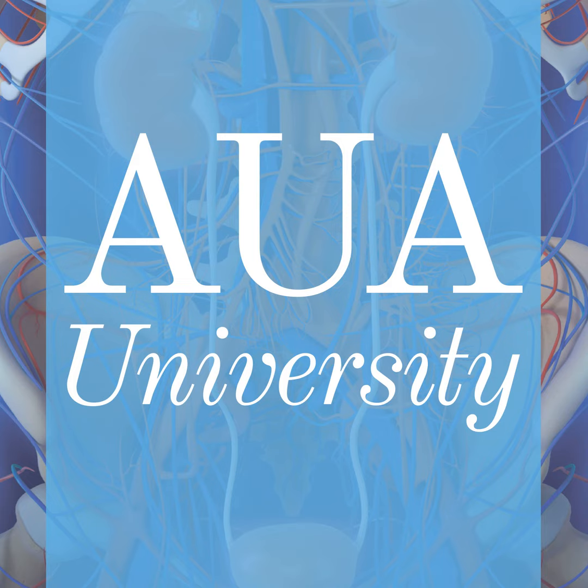So this is basically all that I wanted to say. So use a PSMA PET scan in locally recurrent prostate cancer in order to make your decision if this is a patient for radical salvage prostatectomy.